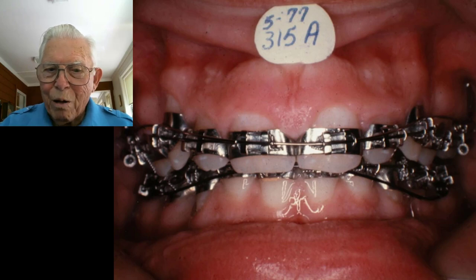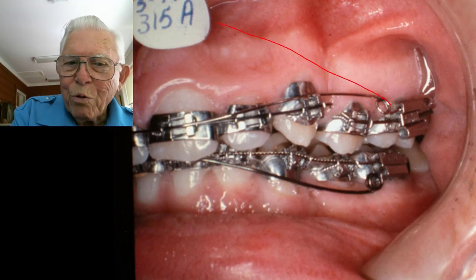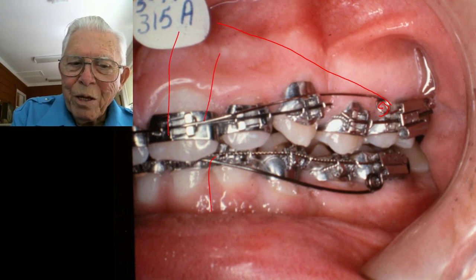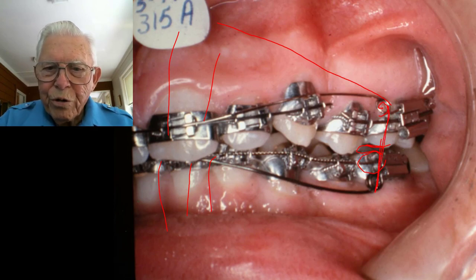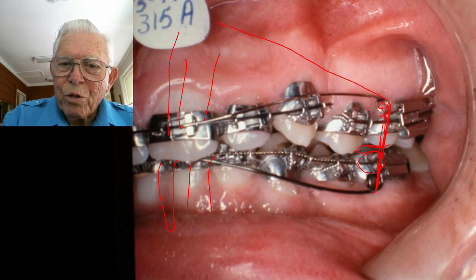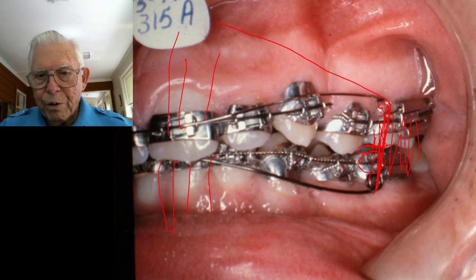You can open the back with those added on top. Here's where we put these little wires — this wire goes way up and when you pull it down you tighten the spring, and it's got a lot of kick to it. It picks these front teeth up and takes the lower front ones down. These posterior teeth move very little. The force out in front looks like it would shove them out of place, but the occlusion — the patient chewing on those teeth — keeps them pretty much in place. There'll be a little space between the six-year molars and second bicuspid, but not a great deal.